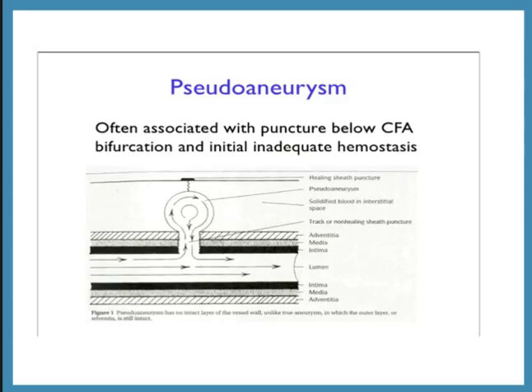It's often associated with a puncture below your common femoral bifurcation, or even initial inadequate hemostasis. So it's extremely important that we hold pressure, and that we hold pressure appropriately.